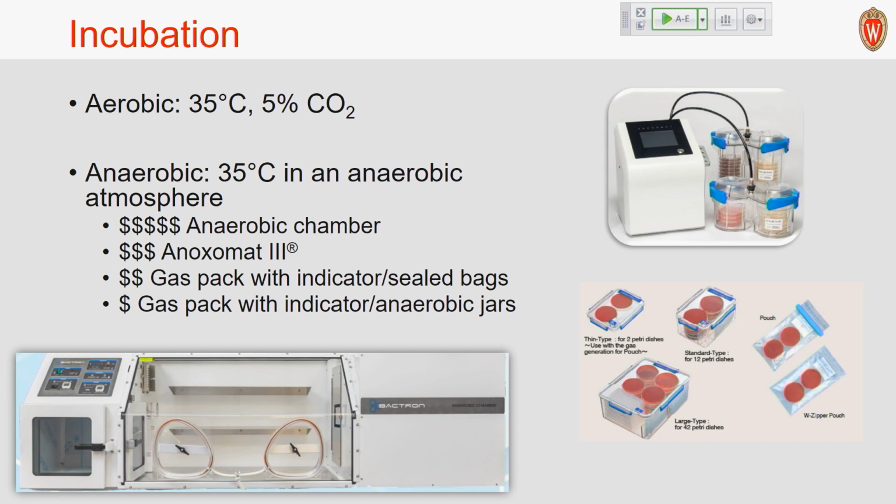It has this airlock here, to move things in and out of the chamber. There's an incubator here, and it's a carousel, so you can put your media in there. You can put pre-reduced media back here, if you so wish. It's very pricey. If you really want to do top platinum level anaerobic microbiology, and you do a lot of it, then this is the thing to get.